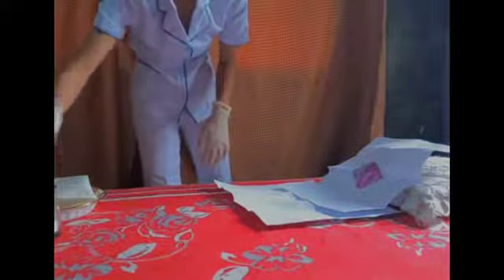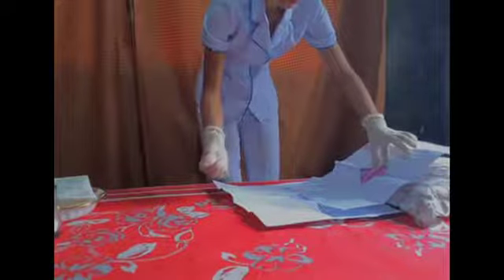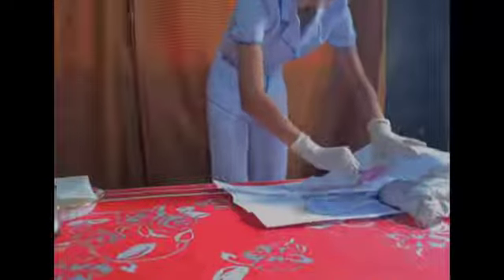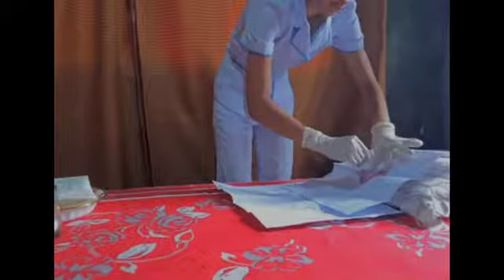With our non-dominant hand, we will use it to spread the labia. The technique for cleansing is from farthest to nearest. We first clean the left side from top to bottom, then the right side from top to bottom, and finally the middle from top to bottom. After that, cleansing of the meatus is complete.